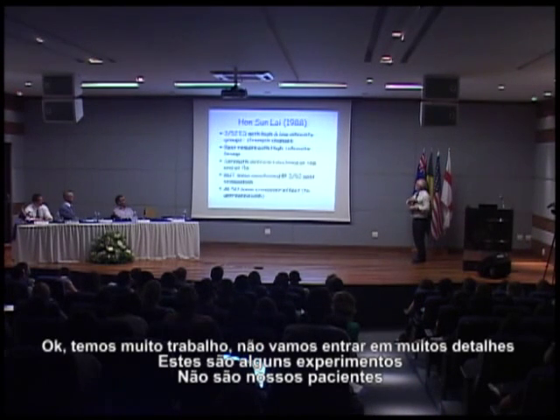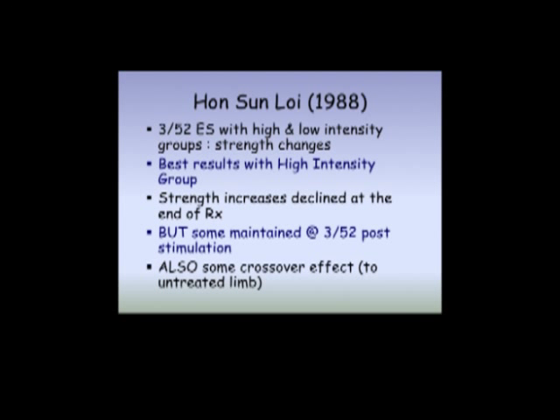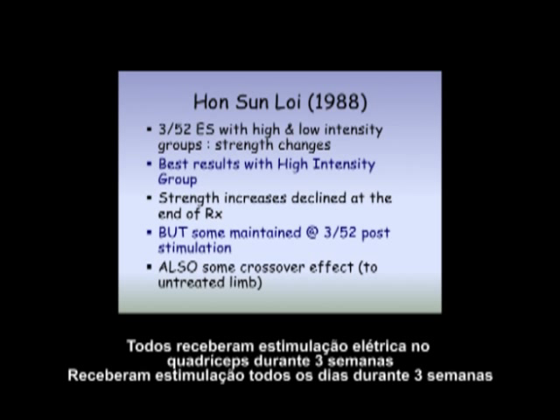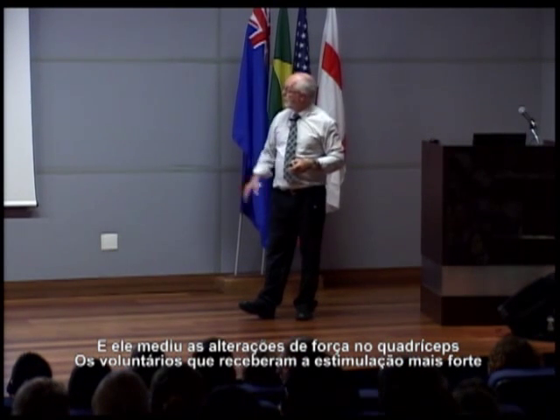Okay, so we've got some work, and we won't do too much detail here. This is just early experiments. This is not with patients. This is with healthy volunteers, athletes. So Hansun Loy does some work, and he has some volunteers, and he divides them into two groups. They all have electrical stimulation to the quads every day for 3 weeks, and he measures their quads change in strength.